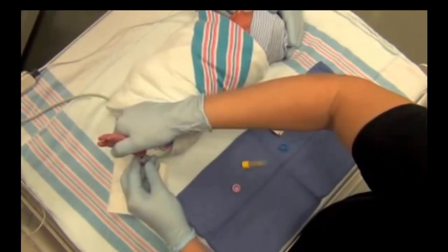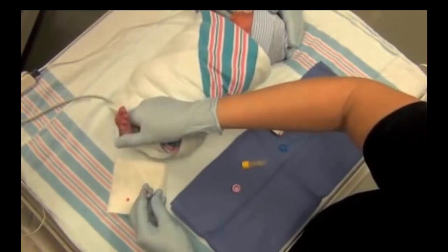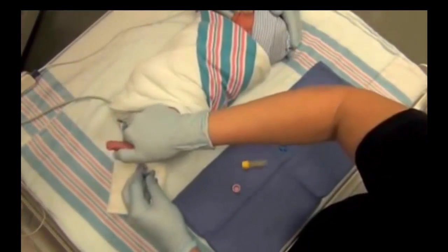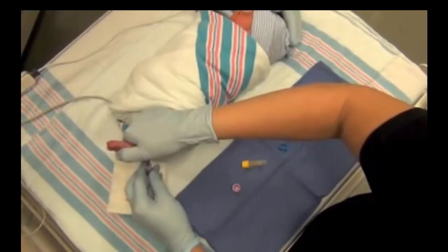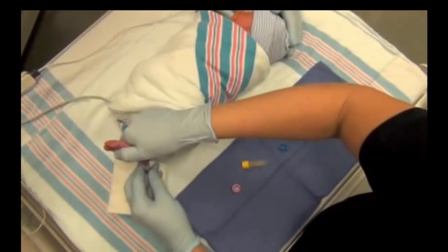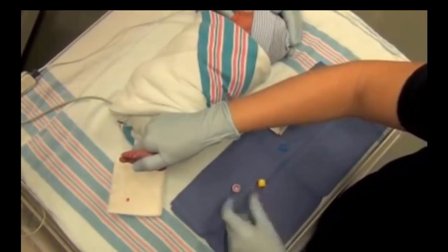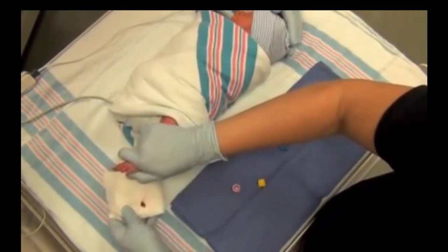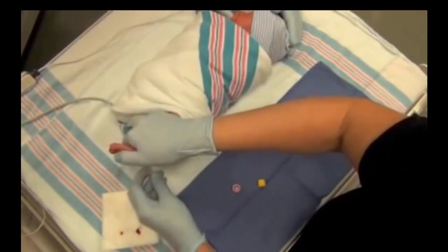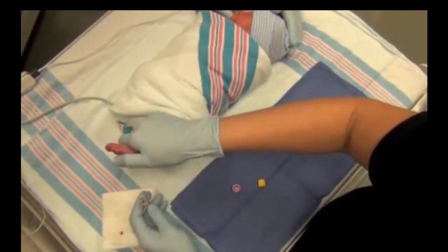Do not squeeze the heel. Squeezing the heel results in greater pain, lower blood yield, and increased cell lysis. If the bleeding stops, wipe the site with gauze to disrupt the clot formation. If the blood still does not flow freely, choose another site and repeat the procedure.